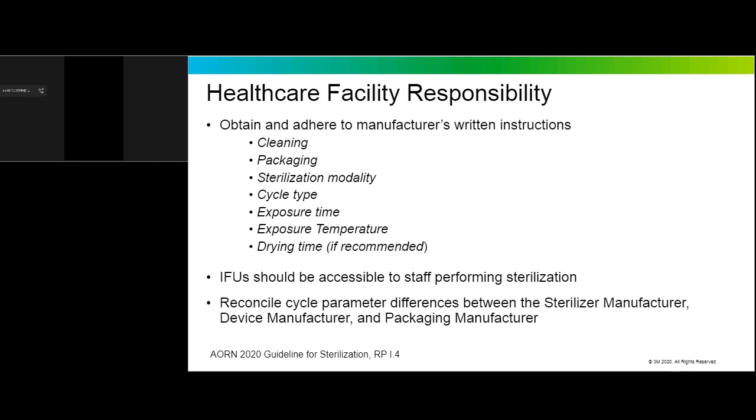AORN provides some good guidance on this, and they say you have to make sure that you know how to clean, what cycle type, what's the exposure time and temperature that you should be running for this particular item. This is an item that surveyors, as we saw from that Joint Commission slide, are also very tuned into, and they expect the frontline staff that's performing the work to have access to those manufacturer IFUs.